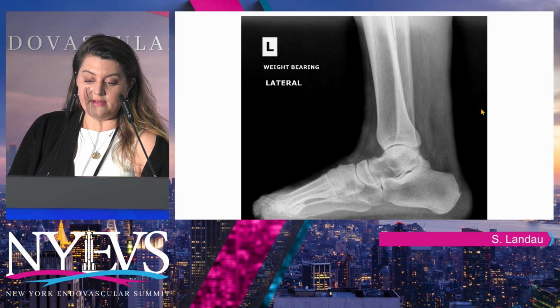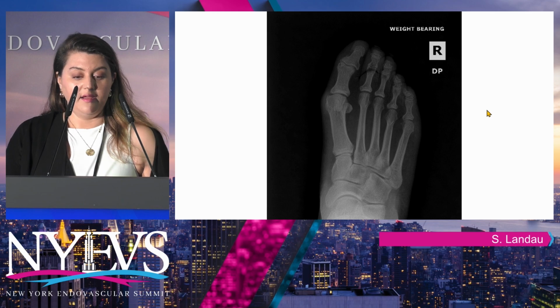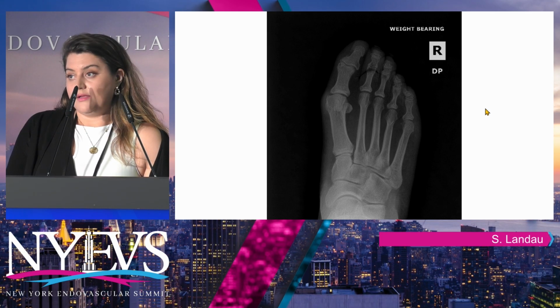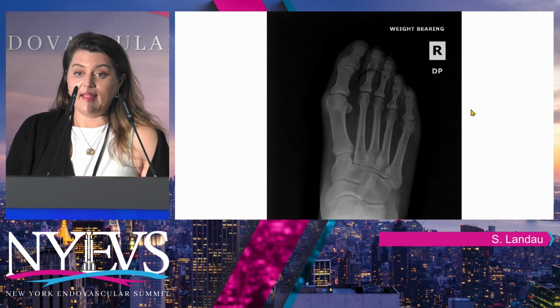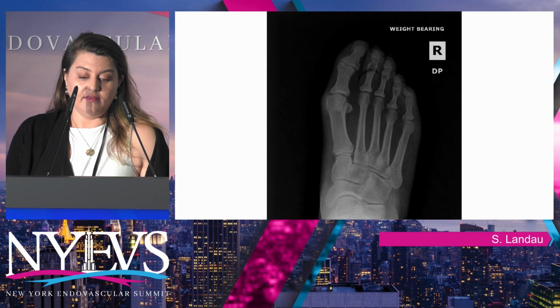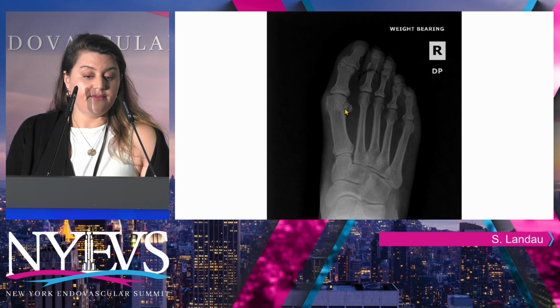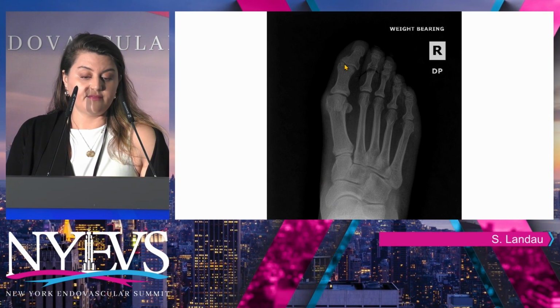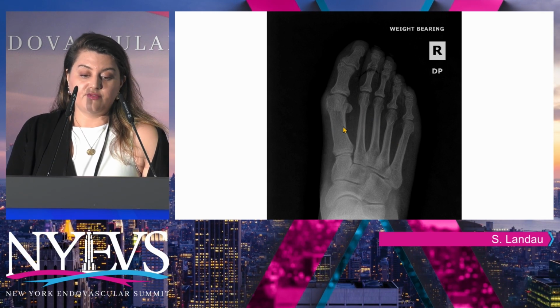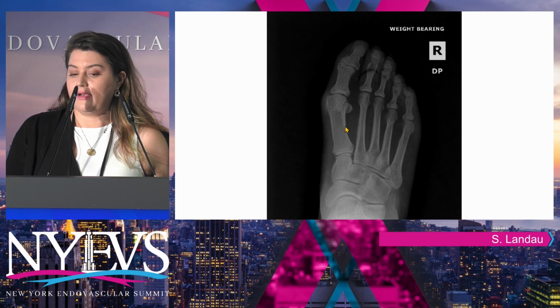And this is the lateral on the left, and I also have radiographs on the right. So whether his right limb was longer initially or not, it's now displaying aspects just from the radiograph that it is the longer limb. His AP axis is going medially. He now has a bunion forming on that side with hallux interphalangeus. The forefoot's abducted. This right first MPJ, first ray, is not bearing the appropriate amount of weight.